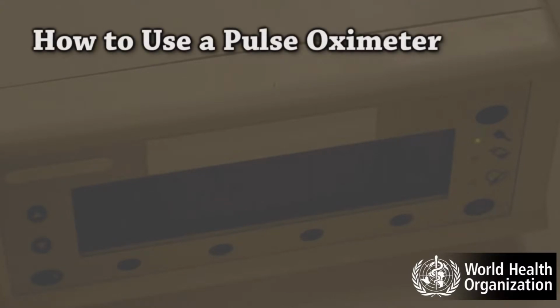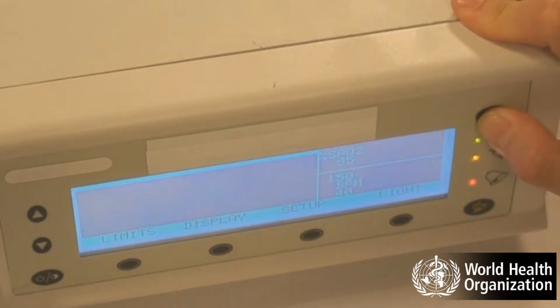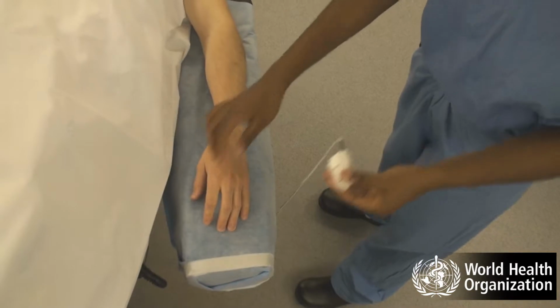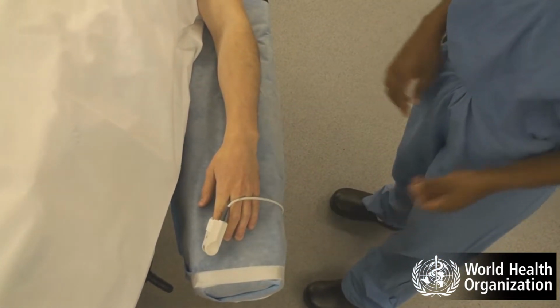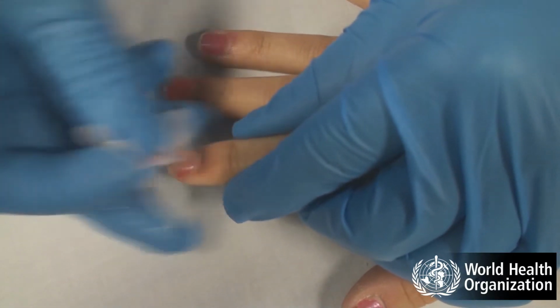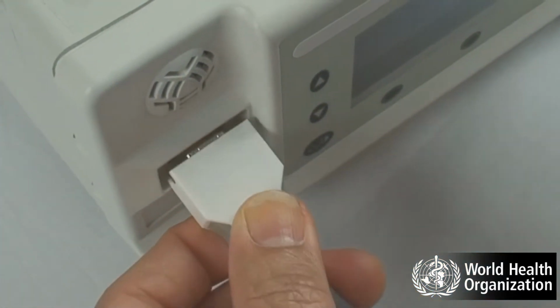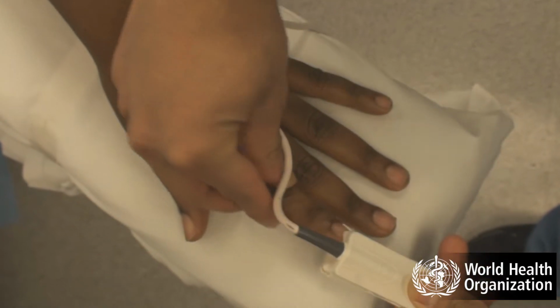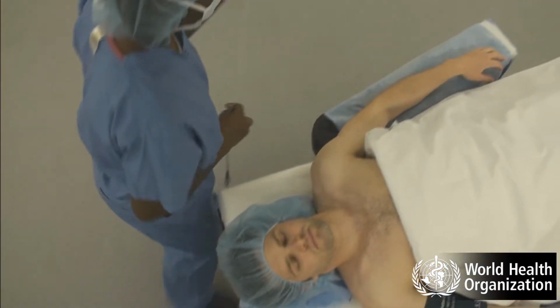How to use the pulse oximeter. Turn the pulse oximeter on. It will go through internal calibration and checks. Select the appropriate probe with particular attention to correct sizing. Make sure the intended placement site is clean and remove nail polish if necessary. Connect the probe to the pulse oximeter. Position the probe carefully. Make sure it fits easily without being too loose or too tight.